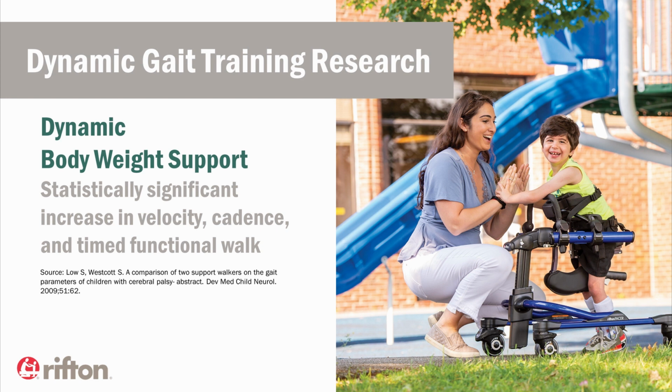Here is some research by Dr. Lowe. She investigated differences in gait characteristics and mobility of children with cerebral palsy when using two different gait trainers. One was a dynamic frame, allowing for up and down displacement, and the other was a rigid frame. So the children had 2 weeks of practice in each gait trainer before the data collection.